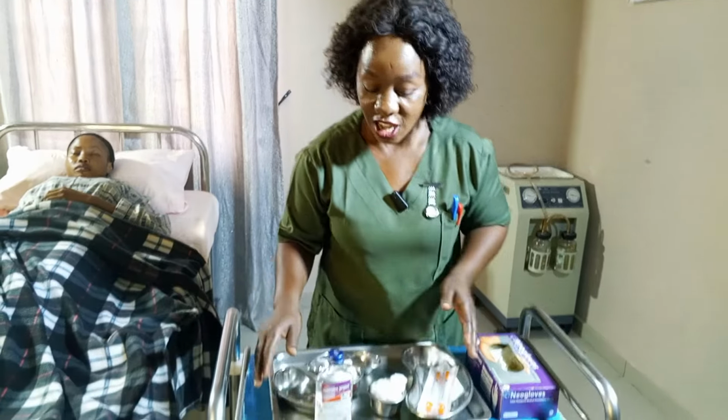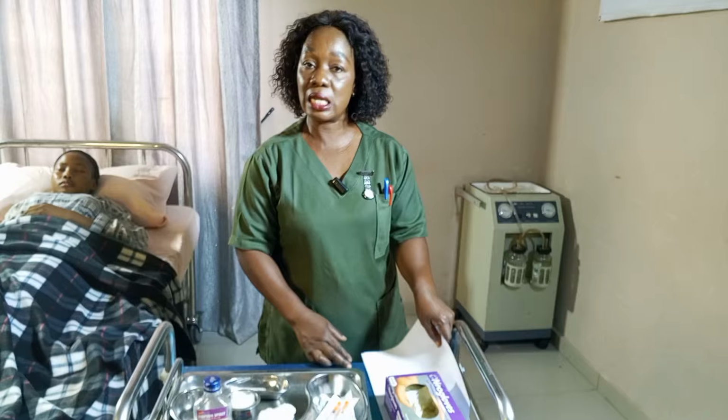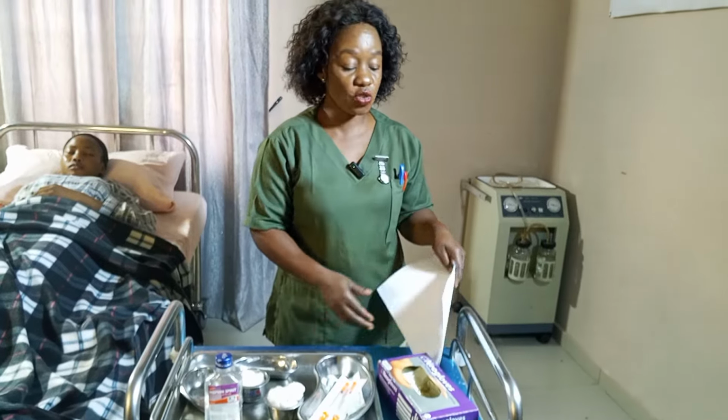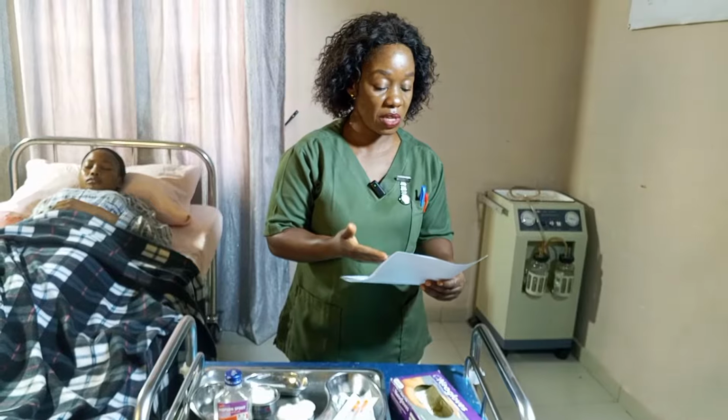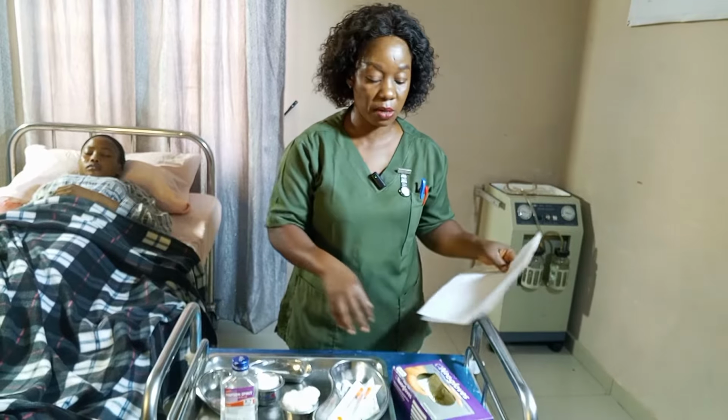Thank you very much. So for us to administer this medication, insulin, the first thing you have to do as a nurse is check your prescription sheet to see the name of the patient and the drug that has been prescribed for the patient, right? So you pick your prescription sheet and check the name of the patient and the prescription. This patient has been placed on soluble insulin, 10 international units. So I've seen the medication and I'm going to identify my patient.